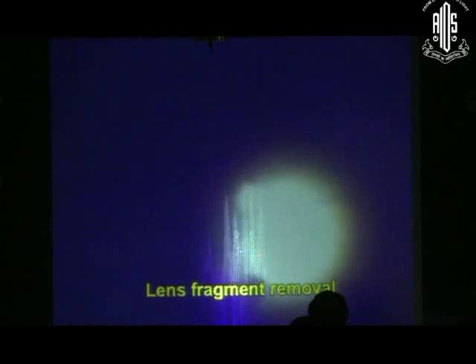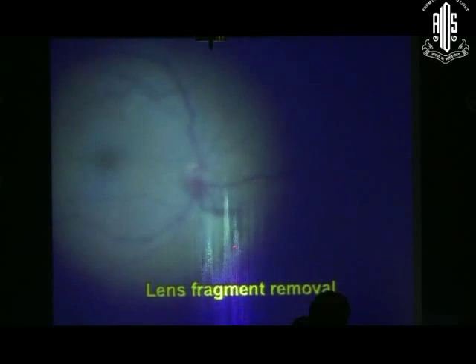Now as you complete the vitrectomy, you need to go on to the illuminating system. And once you have the illuminating and the imaging system, you can go ahead and look at this nuclear fragment, and with very careful removal of the lens fragment, you can see it is small. This is where you want an aspiration first and cutting later. So you just get it up and then you get the cutting, and you can see the pulsations and all, and you have been able to remove that.